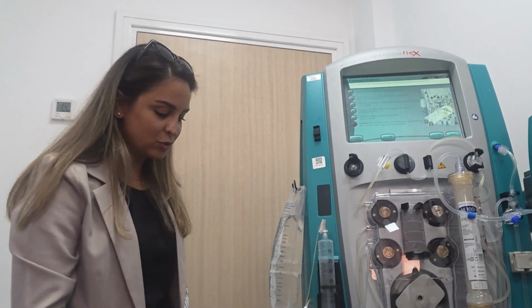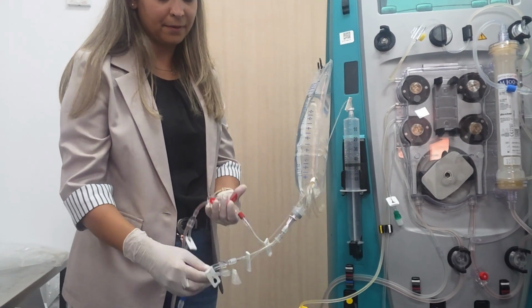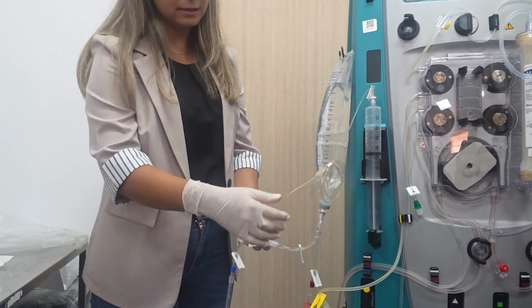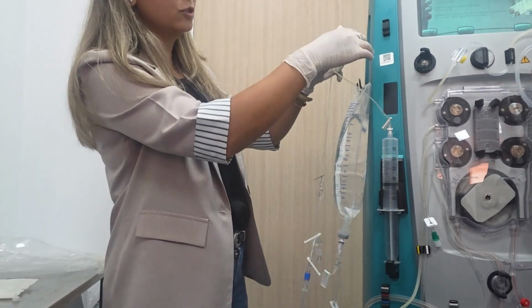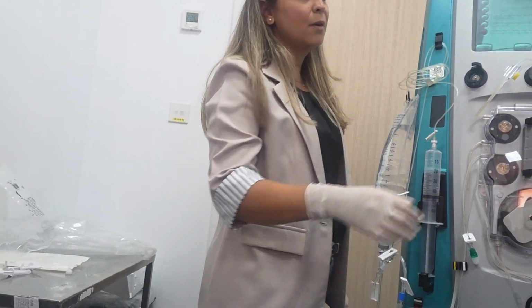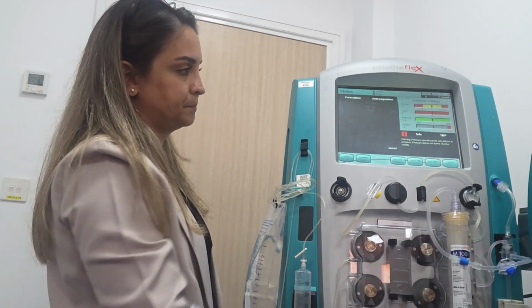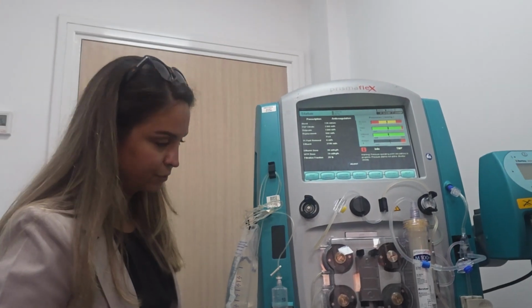The last step is to unclamp. Unclamp the catheter. Unclamp the access, the Y line or your three-way, the effluent, sorry, the return, effluent, and the calcium line is also already unclamped. Now we can press continue, and of course you can connect the warmer anytime. Then you can start. So let me just make the pressure correct.